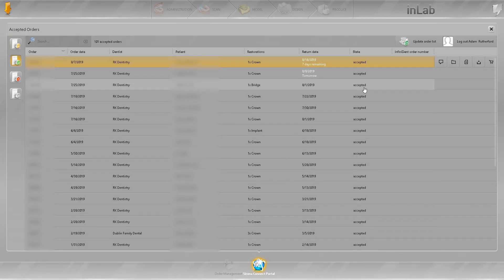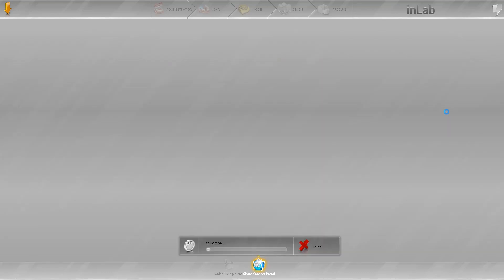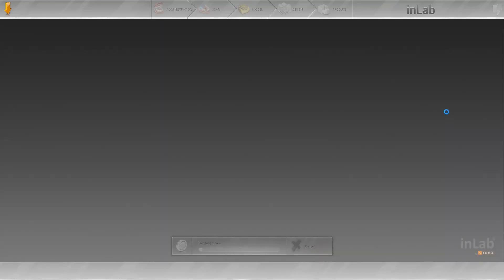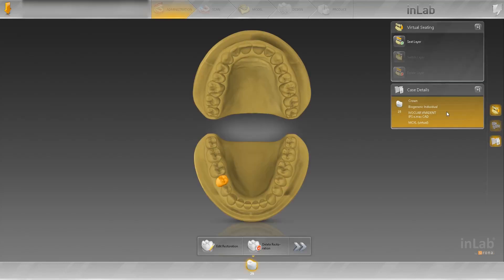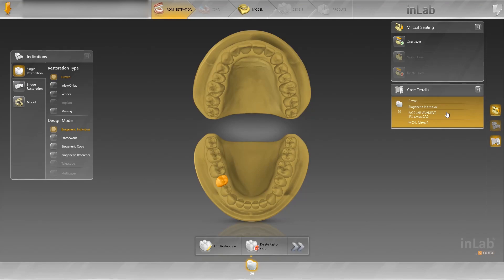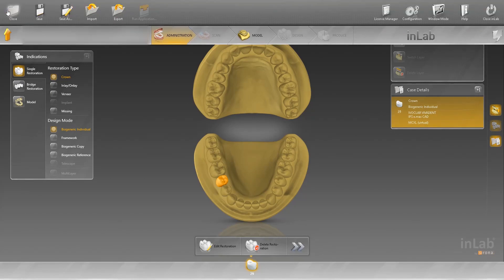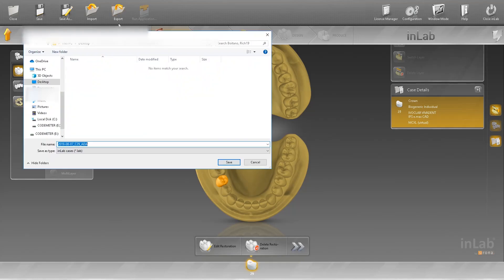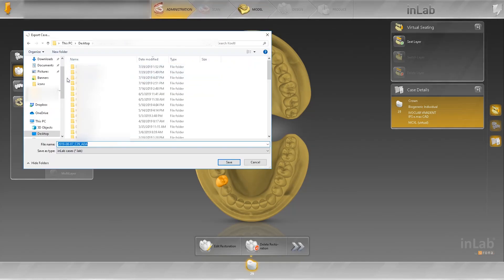Accept. And then we are going to download and open the case. This will take a second here and we'll get going. Okay, there we go.